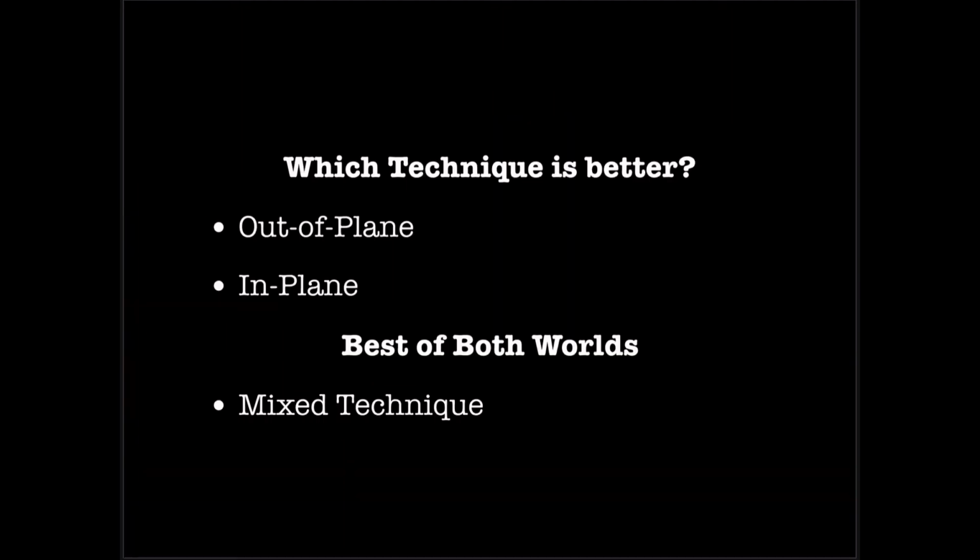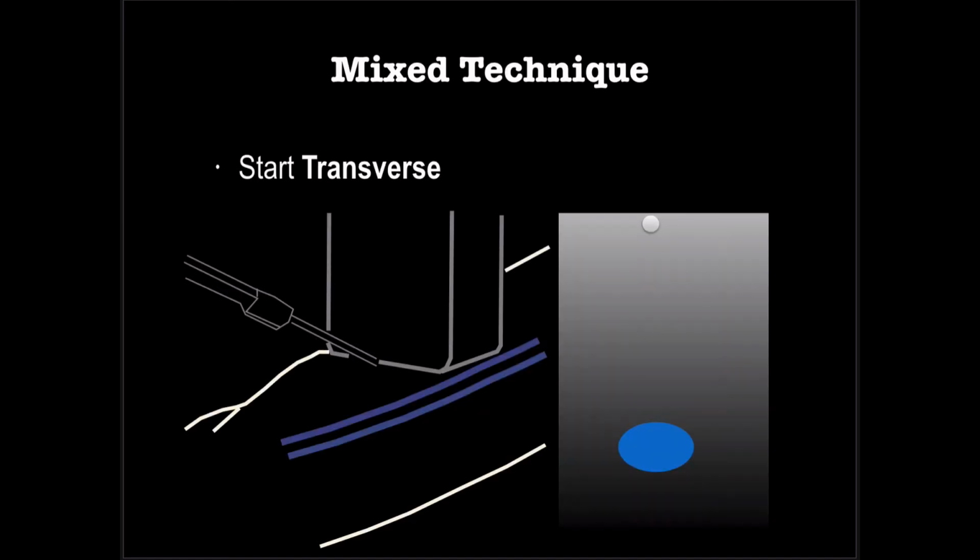So which technique is better? Well, for vascular access, I'd suggest you use a mix of both of them. So let me show you what that looks like. We're going to start off transverse. We're going to identify our vein. We're going to do the compression technique.